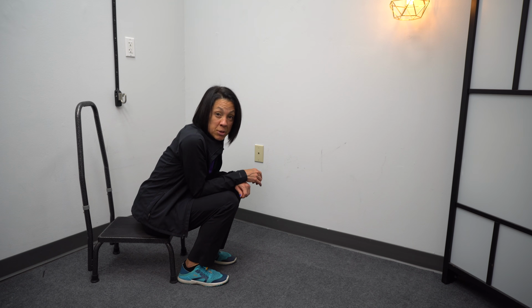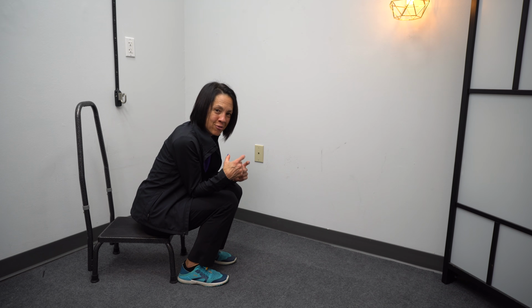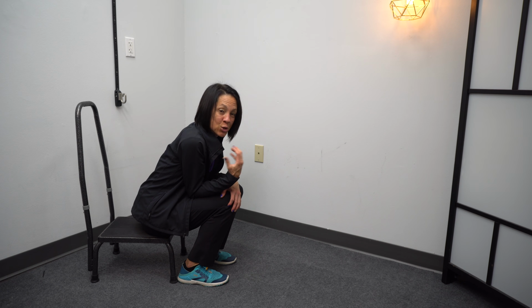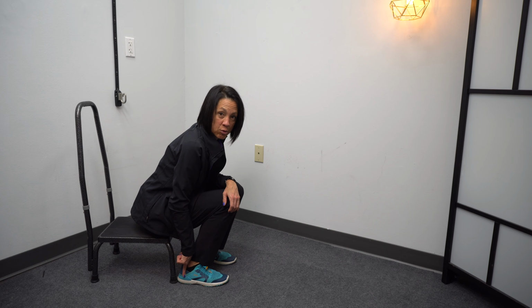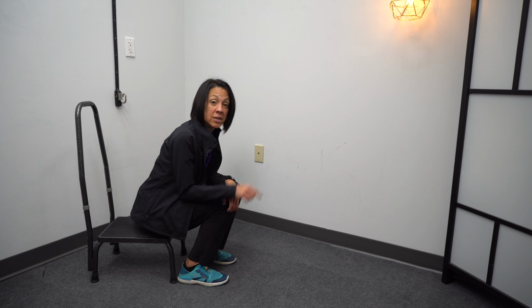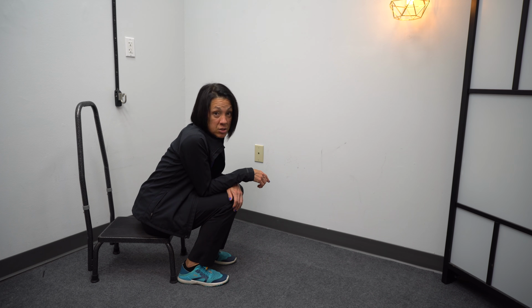The other reason I like it is because you can get a lot of body weight over a very small area. So notice my hips, my shoulders, every ounce of my body weight, for the most part, is a force going directly down through that heel, really allowing me to deepen that stretch. So it's very hard to cheat or compensate in any way. All of that force goes directly into achieving that ankle dorsiflexion.